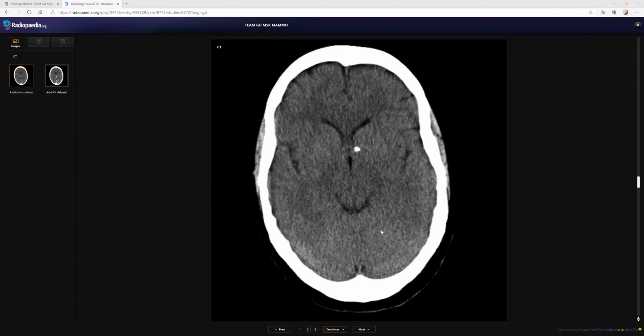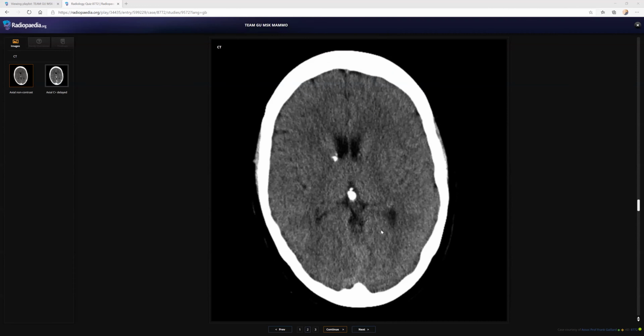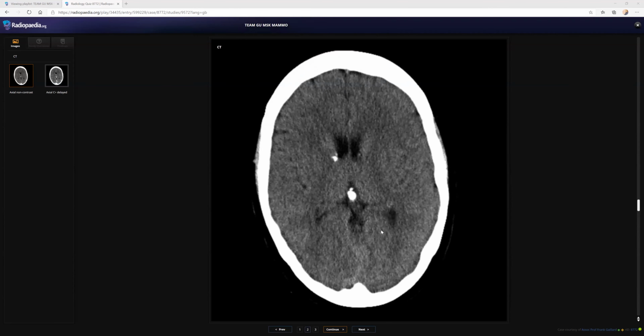I will refer my findings to the physician and ask for hereditary screening, as well as a follow-up scan to look for any complication of angiomyolipomas if they are more than 4 centimeters. Okay. Fine.